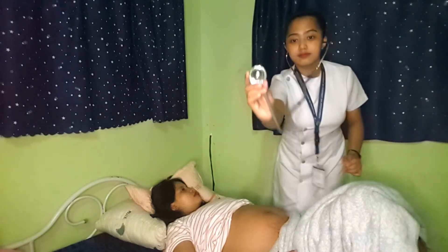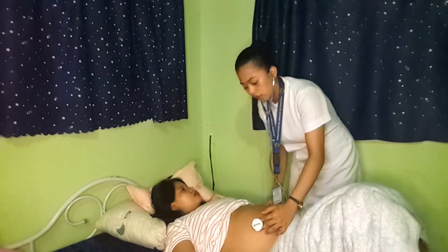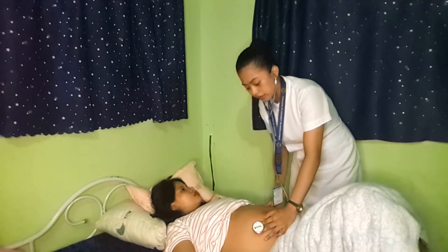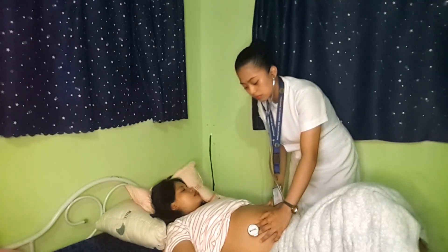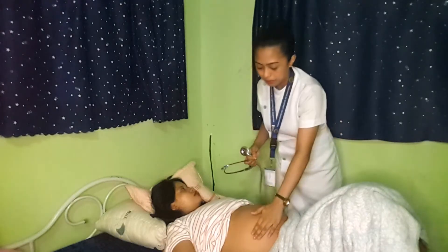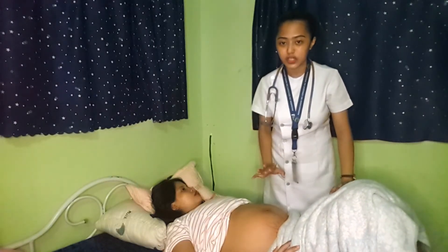We will be needing a stethoscope, using the bell. We need to open it and feel here for the fetal heart rate. When we finally hear the heartbeat of the baby, we need to count for 60 seconds, approximately 1 minute. The normal fetal heart rate should be 120 to 160 beats per minute.